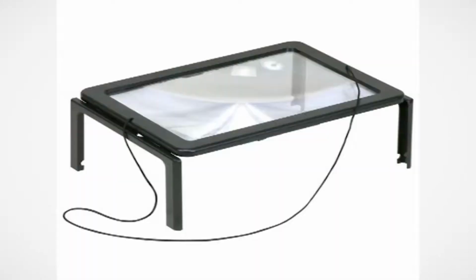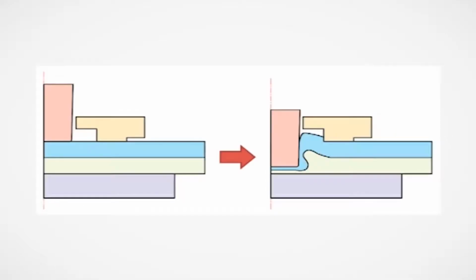Disadvantages: they have limited mobility, being inconvenient to carry around. They are awkward to use on non-flat surfaces. They require the use of a reading stand. They have a very limited field of view.